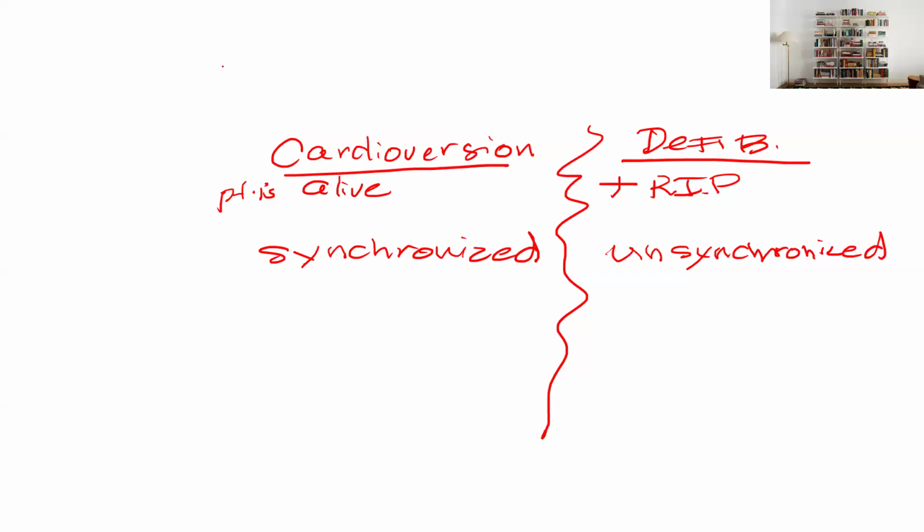Okay, so in the electrocardiogram, I'm going to draw the waveforms. This is a P wave, Q, R, S, and then a T wave. Now, whenever we have an electrical impulse occurring at the vulnerable period, meaning at the special area of the electrocardiogram, it will cause cardiac arrest. Now, why is it that some people get electrocuted and they are going to be okay?